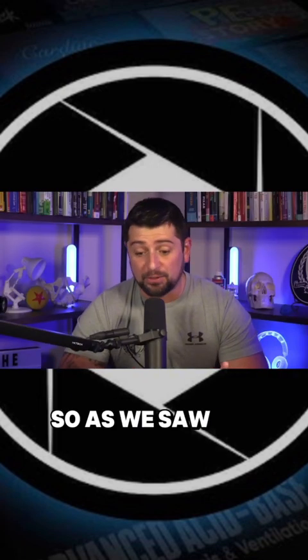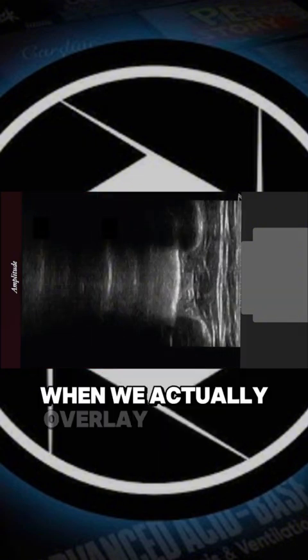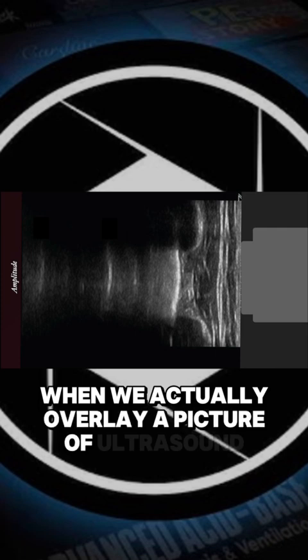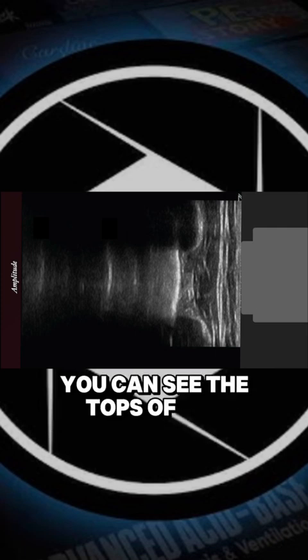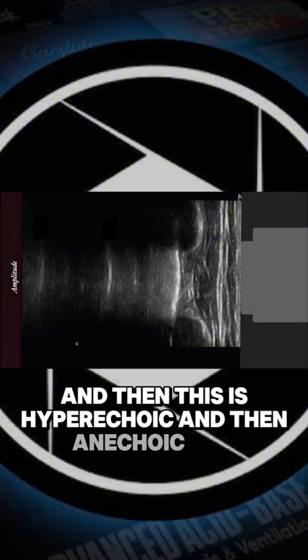So as we saw, the ribs are going to echo back a lot of that sound right away, which means, well, we don't collect any information below the ribs. There's nothing coming back to the transducer element. And we could see that here when we actually overlay a picture of ultrasound. You can see the tops of the ribs here are hyperechoic, and then we go anechoic. And then this is hyperechoic and then anechoic.